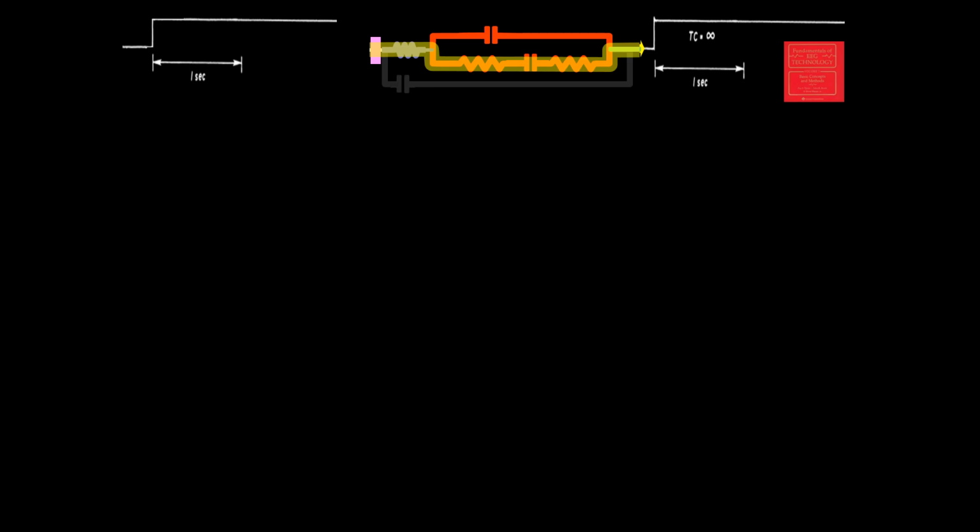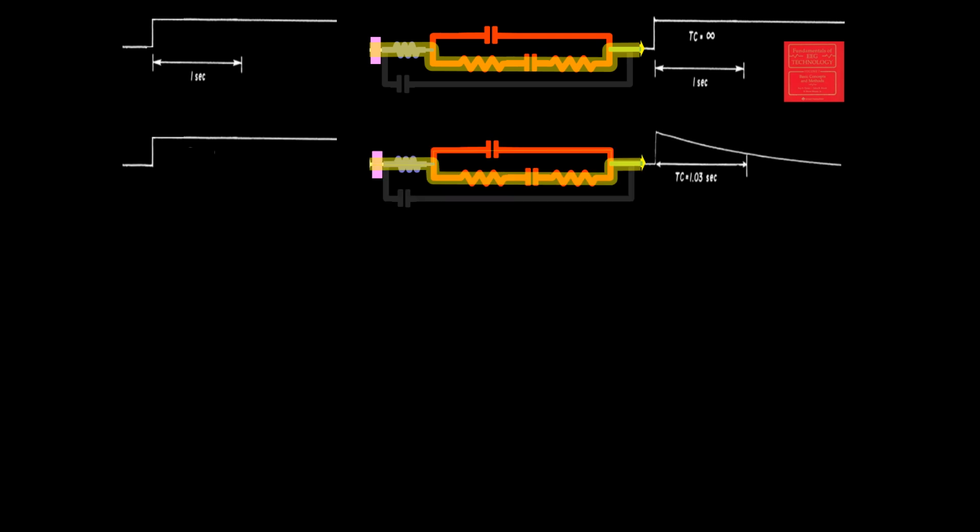Such an electrode and connection would yield, at the level of the pin of the electrode, a carbon copy with a smaller amplitude of the current introduced at the level of the skin. In the example that I have just introduced, the electrical double layer has a higher resistance, so some of the current injected at the skin will go through the capacitor leg of the circuit. This current is here represented by a thin yellow line.